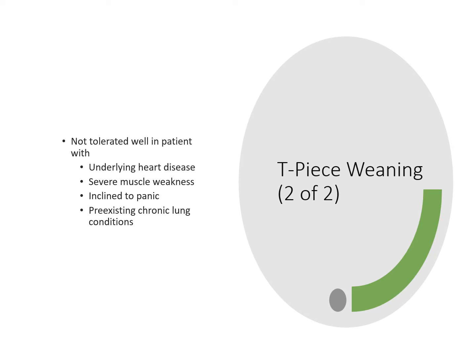That's what I've been telling you in the past. We've had patients that have failed weans on traditional pressure support ventilation. And then we've tried SIMV and it worked. I've had other patients that failed traditional pressure support weaning, and we've tried T-piece. Those are my heart patients where they're on the vent because of hemodynamics, and we're trying to figure out if their heart's healthy enough to come off, right, with that reduced pressure support level, with no pressure support, sorry.